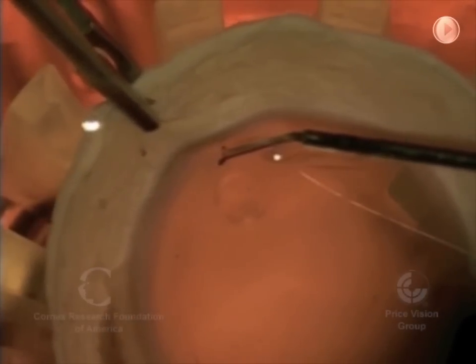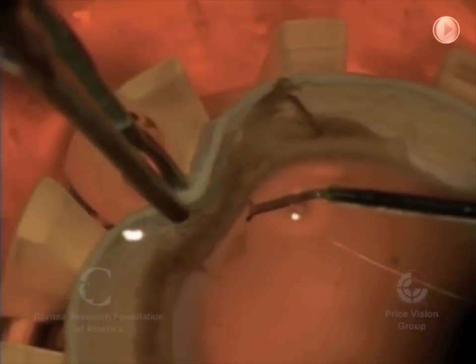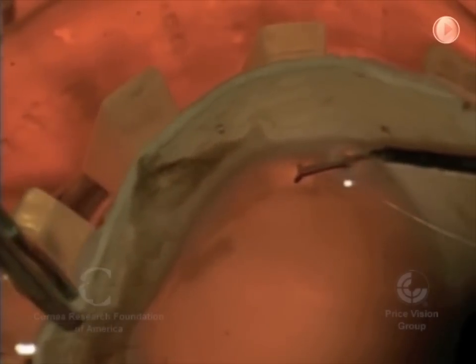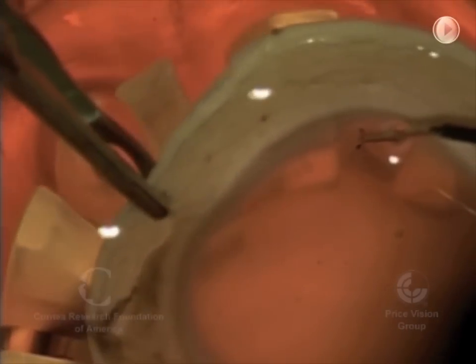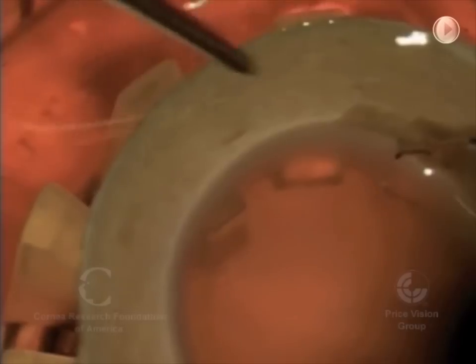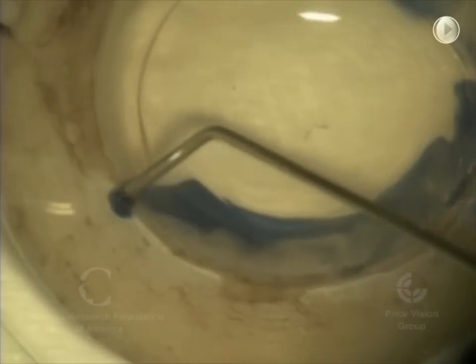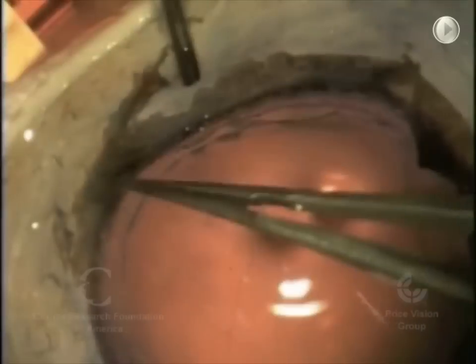We're going around the edge with a special instrument to basically score Descemet's membrane. And when you watch the videos of the actual surgery, we'll see how we score it on the patient's eye. We're going all the way around the edge here, scoring Descemet's membrane.